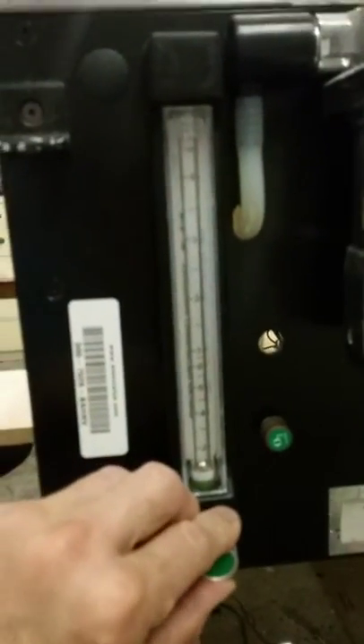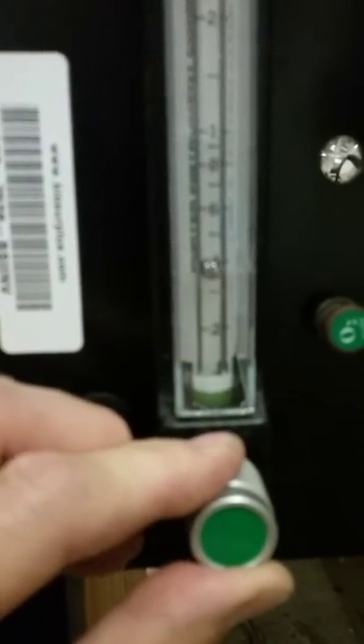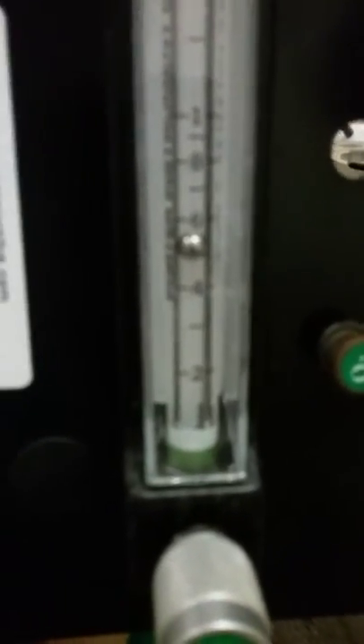That will allow the oxygen to flow through that tube up into the adjustable flow meter. We usually set this at about half a liter — it's a lefty loosey turn again. The lower numbers are decimals; if you go higher it goes to one, two, three, four, and then six liters per minute — that's much too much in flow rate.